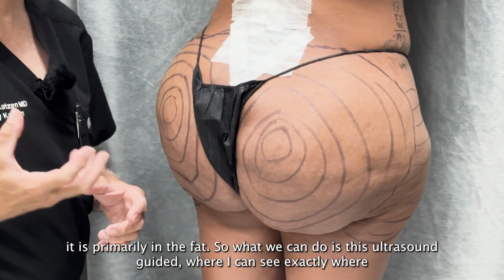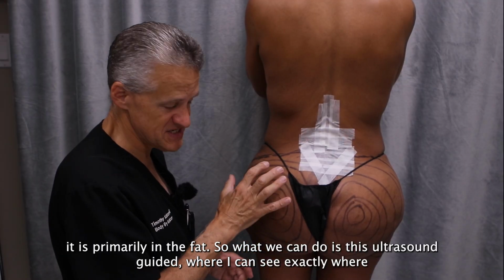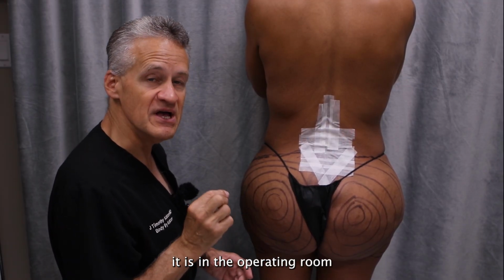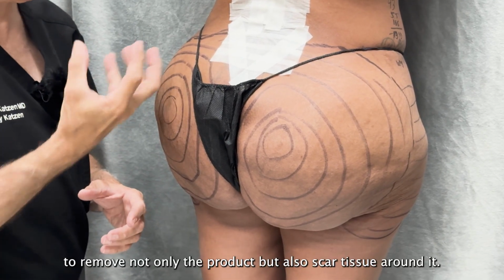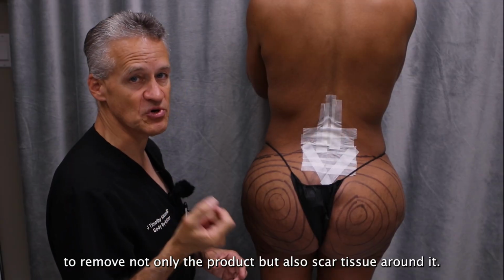So what we can do is this ultrasound guided, where I can see exactly where it is in the operating room. Vaser assisted, that helps me melt the scar tissue, and then we use suction to remove not only the product but also the scar tissue around it.